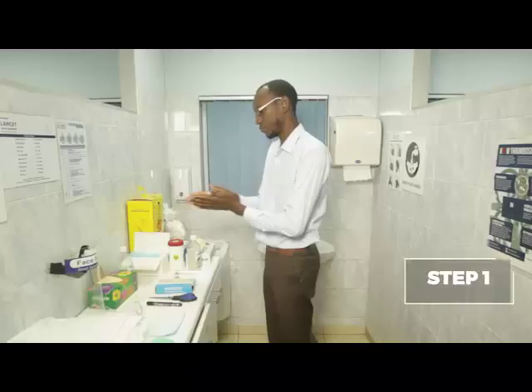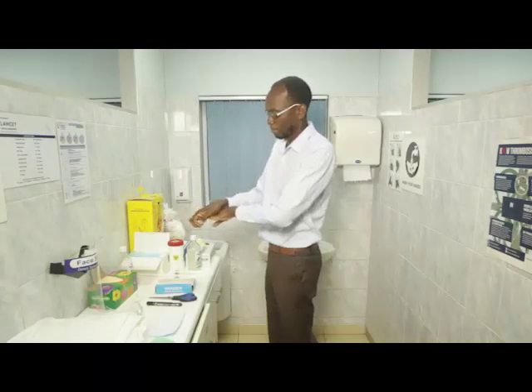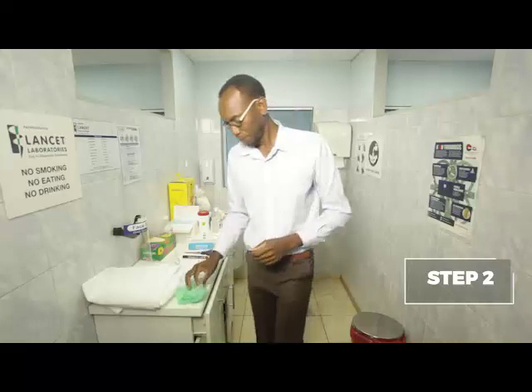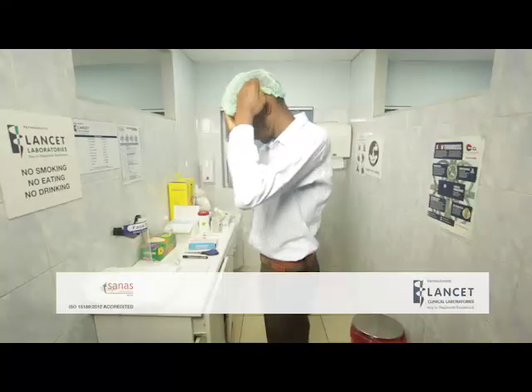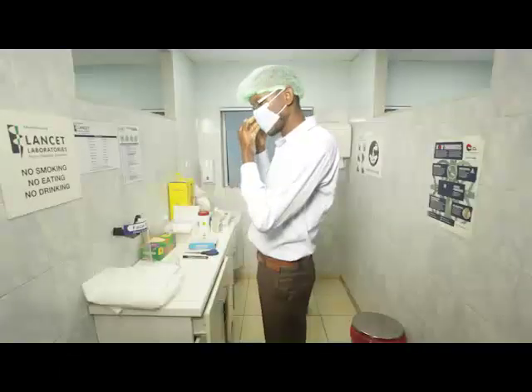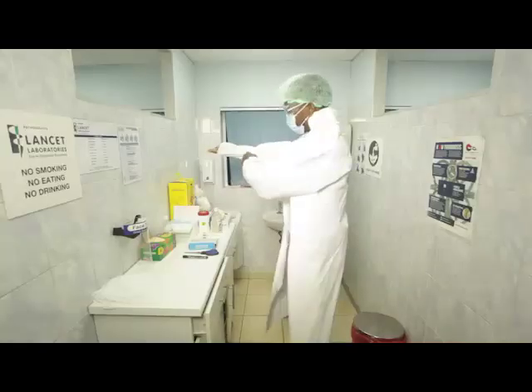Step one, wash your hands thoroughly with soap and water or alcohol-based sanitiser. Step two, it is important to wear appropriate PPE in the following order: a cap, mask, goggles, gown, apron, and gloves.